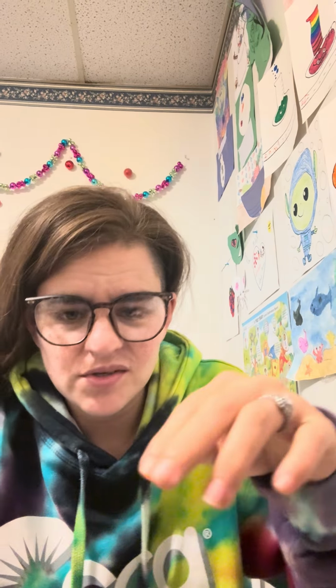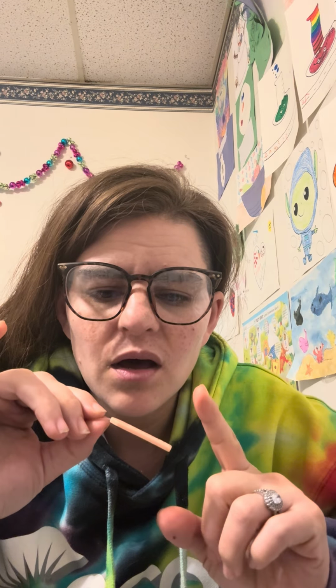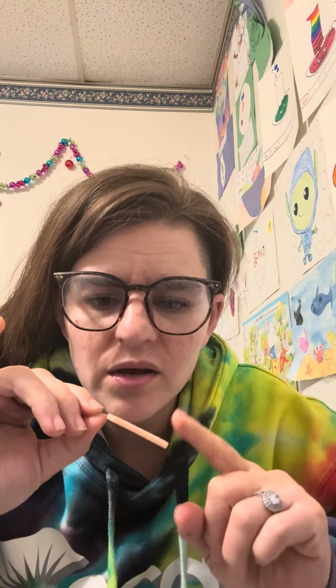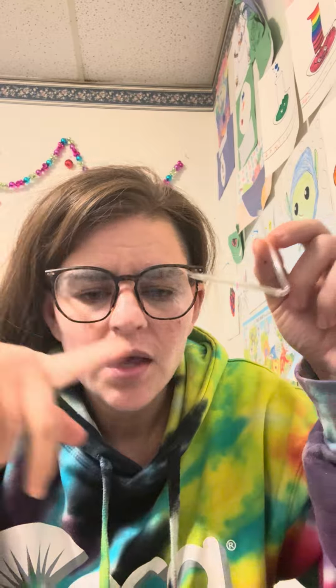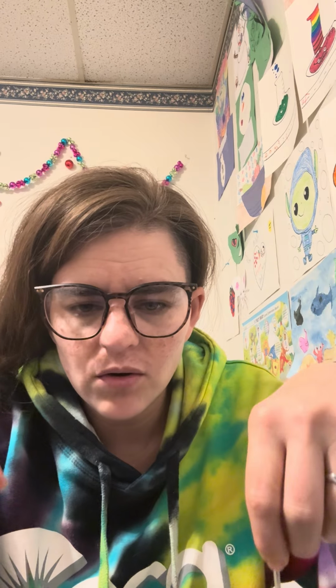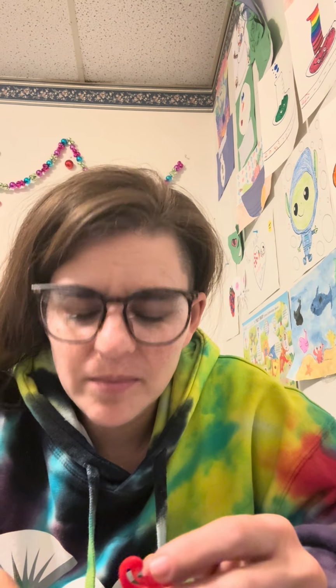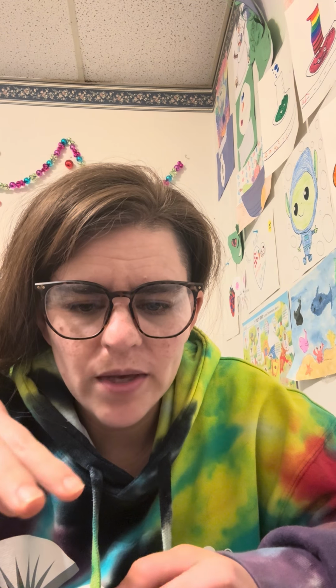This is called a tube puller. This is just like a nylon thread, and then this is the handle. It's real flat for whatever reason. There's a whole bunch of different handles that are flat or not. They sell these on Amazon, Microsonic, and the ADCO website, which, by the way, is where I get my tubing from. They sell Microsonic tubing, but they do free shipping to the lower 48 of the United States. You can also get them on the Microsonic site. You just have to check. Or your audiologist might sell them, or you can sometimes get tubing free at your audiologist. Mine doesn't do that, but that's another story.